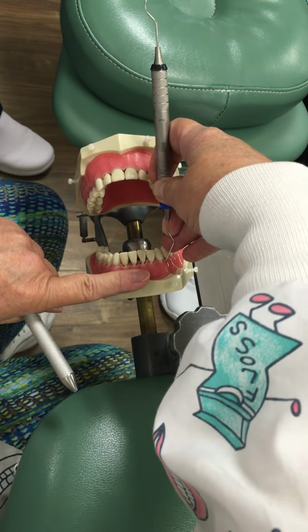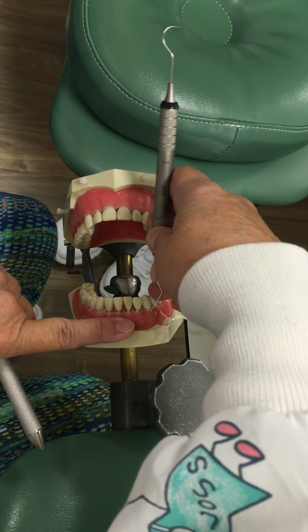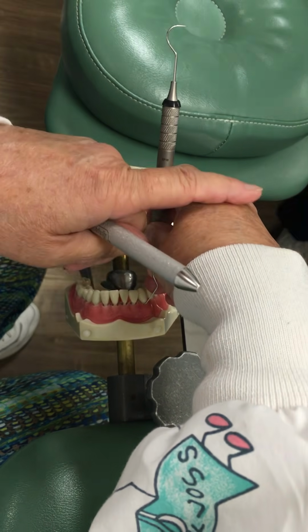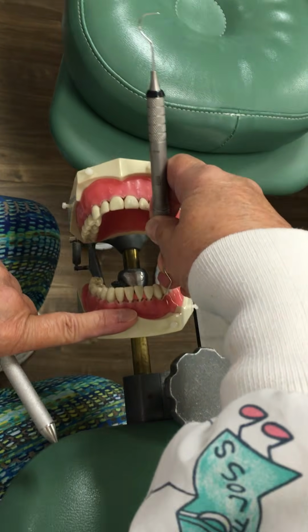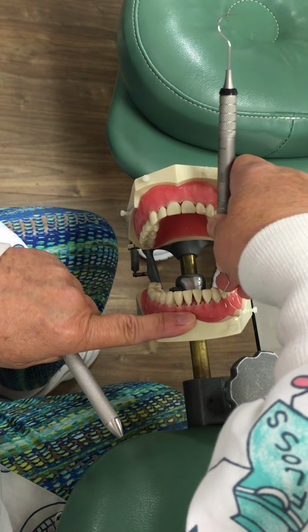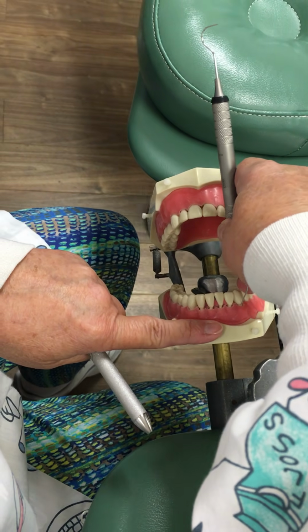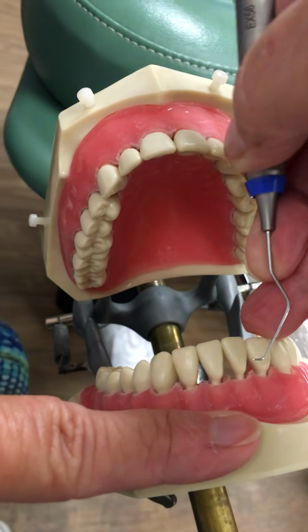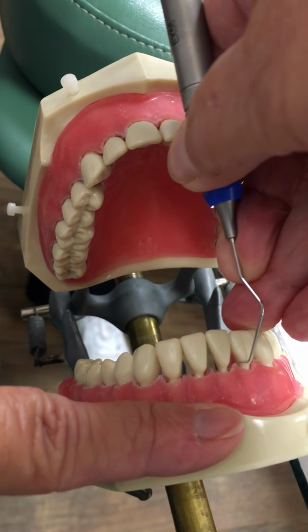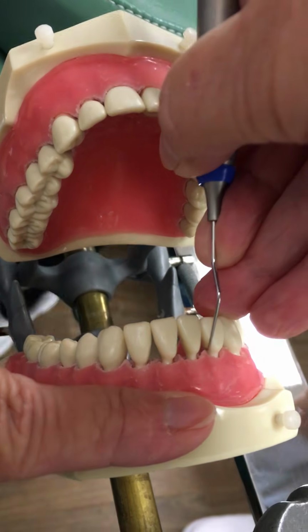All right, so we're going to start at the middle like we did before, just on the other side of it. Modified pen grasp. Standing up on our fulcrum, but yet we have a neutral wrist and our toe on the tooth, fingers all together with our modified pen grasp, and our hand leaned toward the maxilla, and we may rub on those top teeth, and that's okay. And as you come around the corner, you want to make sure that that shank is parallel to the long axis of the tooth. So you have to kind of lean your hand in the toward direction as well.